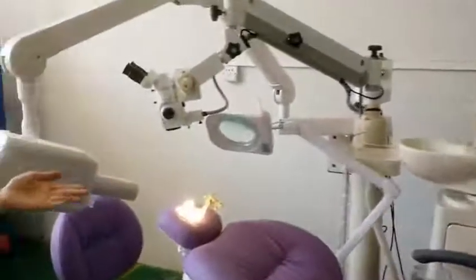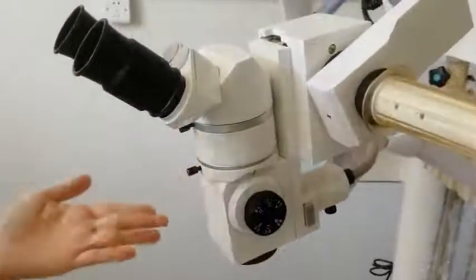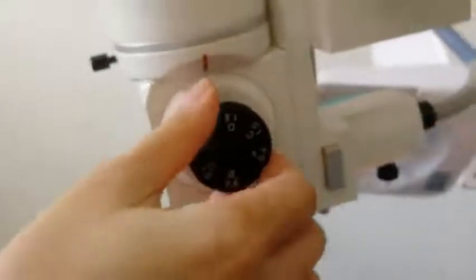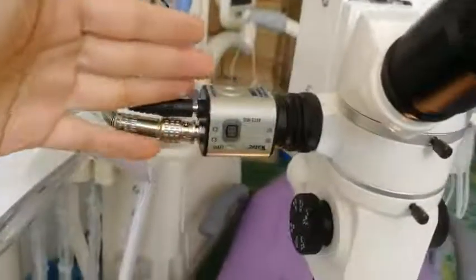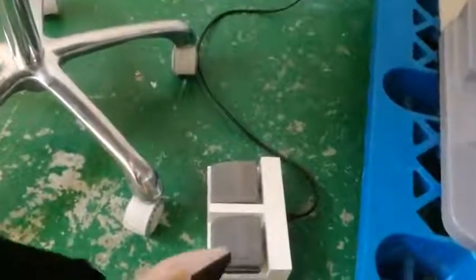We will see the details one by one. First, we will see the microscope. It is with five different magnification levels. The biggest one is 20x magnification and the dentist can choose according to his need. The working distance is good for the dentist, and this microscope comes with a foot pedal. When the dentist is walking, he can adjust the microscope by leg for up and down.